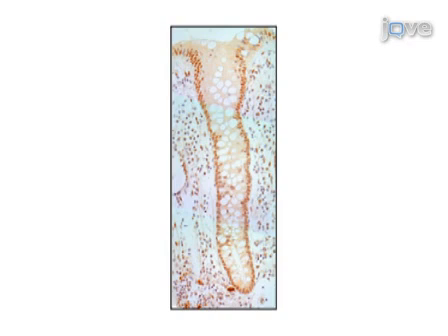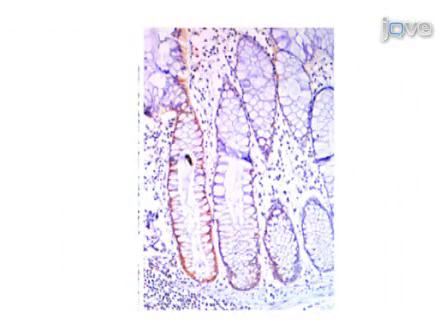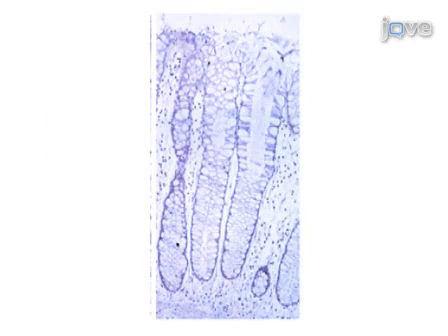For example, this image shows brown staining indicating high levels of expression of ERCC1 in colonic mucosa without colonic neoplasia. This next image shows brown staining indicating high level of expression of Pms2 in colonic mucosa of a patient without colonic neoplasia, while an area of colonic mucosa near a colon cancer shows one crypt with high Pms2 expression and some with low expression, and another area near a colon cancer with absent expression of Pms2.